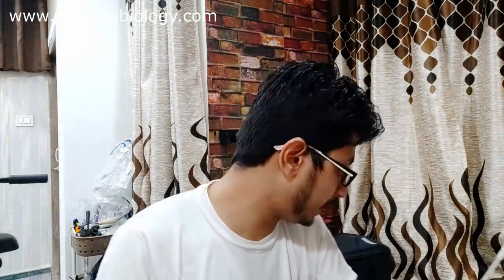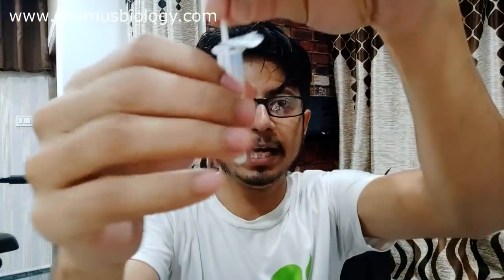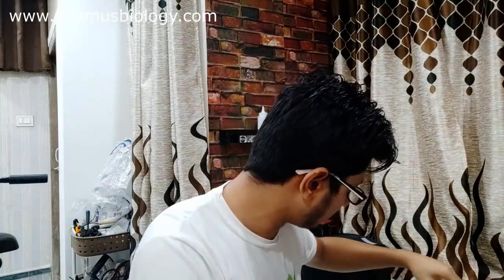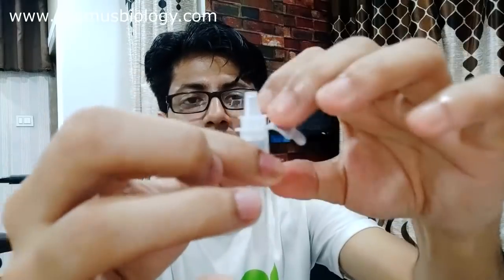It may cause a sneezing effect — that's fine. Now take the buffer solution and insert the swab into the buffer, then mix it vigorously — about eight to ten times — until you get a clear mixture. Mixing is done. Throw the swab into the disposal bag, then take the cap and put it on the buffer tube. Don't touch the tip of the cap.